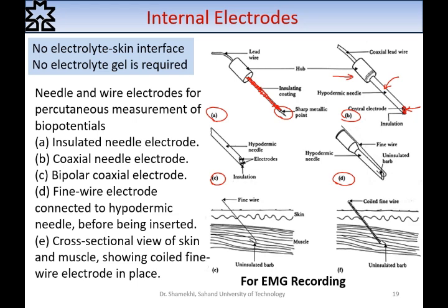The main recording part of this electrode is here. The outer conductive layer is used as reference. These coaxial needle electrodes have their own reference.